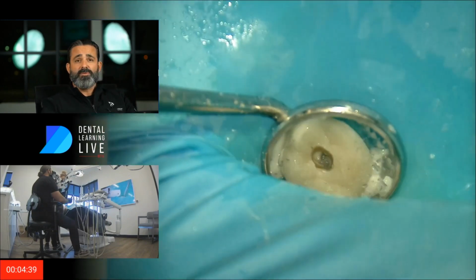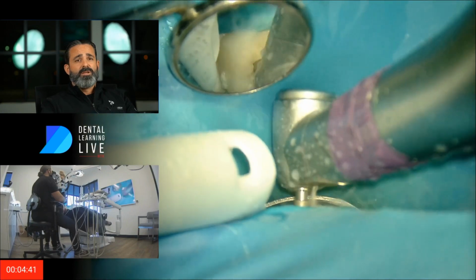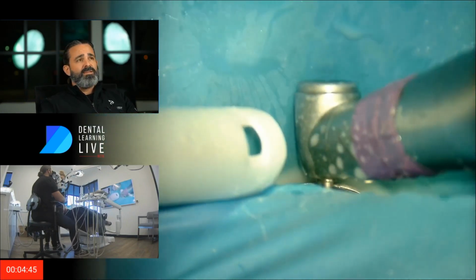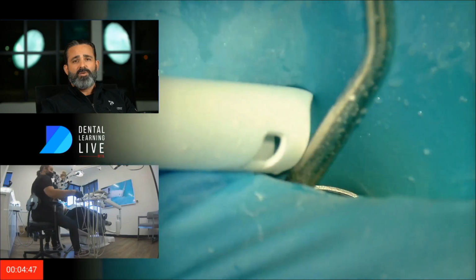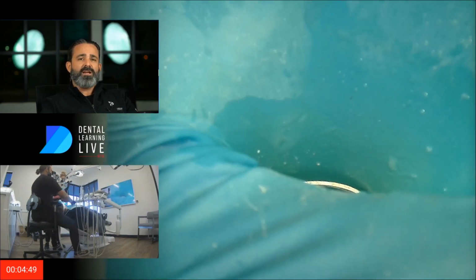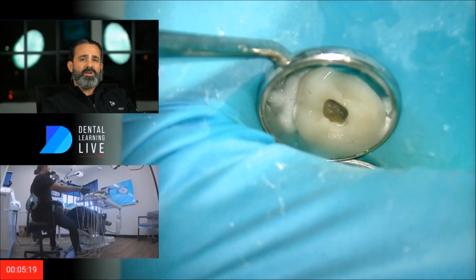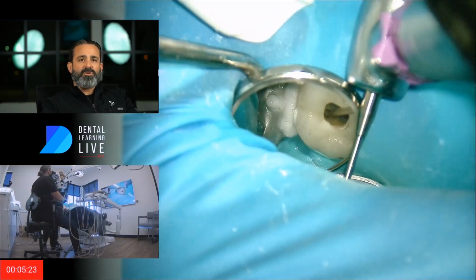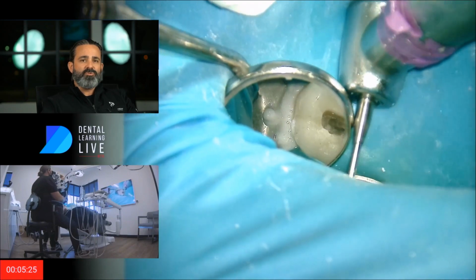I don't know if it was done by an endodontist or a specialist. I did a survey for the AAE and spoke on what that means. If you ask whether it was done by a specialist or a generalist, and what your bias is when something looks good, would you retreat it regardless?